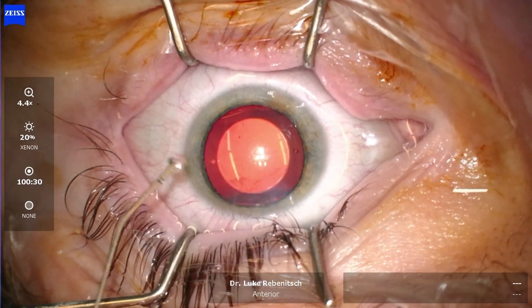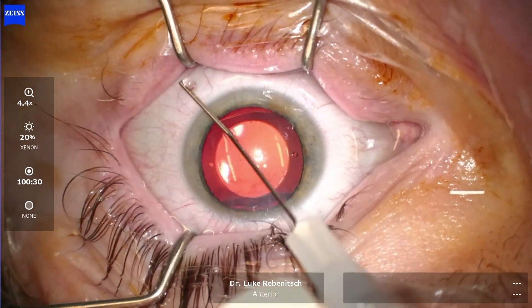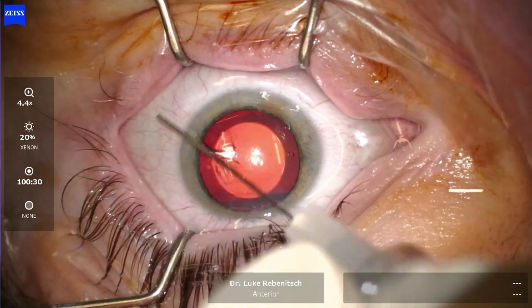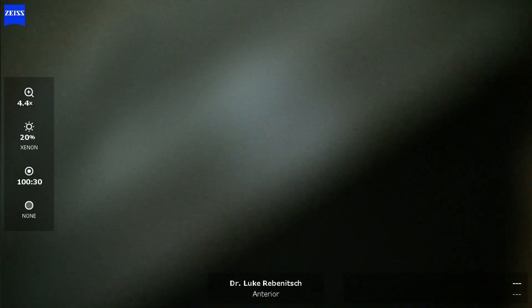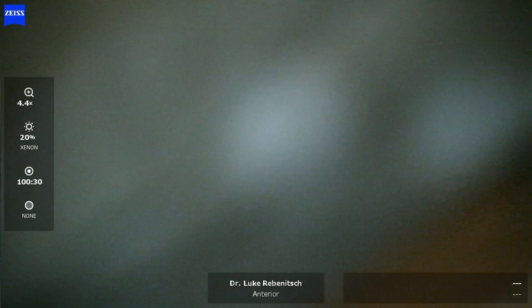We also make sure that the pressure inside the eye is physiologic, or normal, which we see here. So congratulations to this patient — he now sees much better.